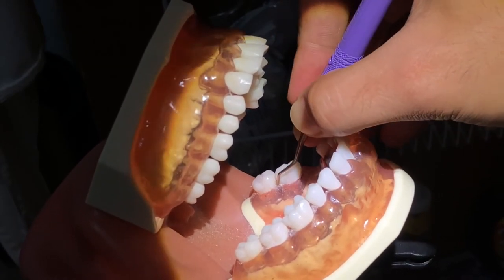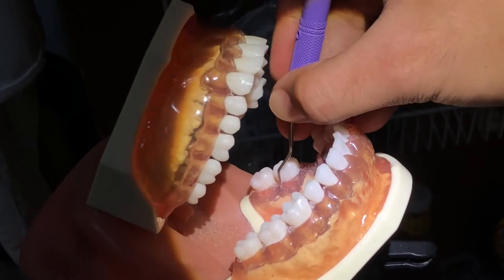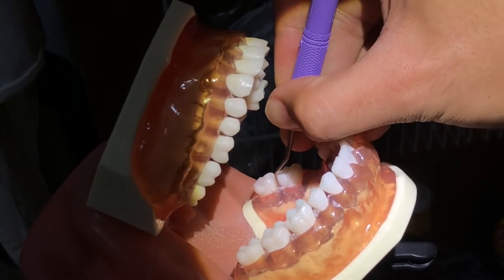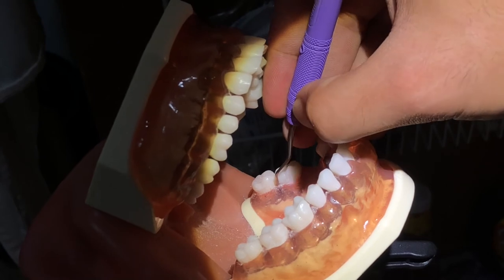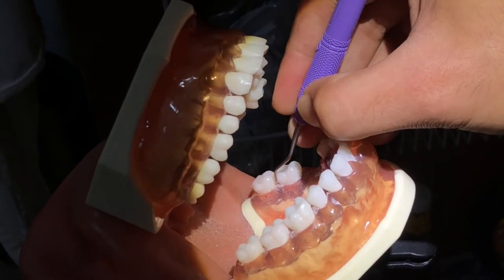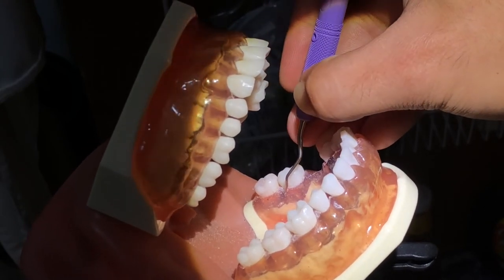And then close the blade, take it out, and then reinsert again. Open the blade and then activate. Reinsert again. Open the blade and then activate.